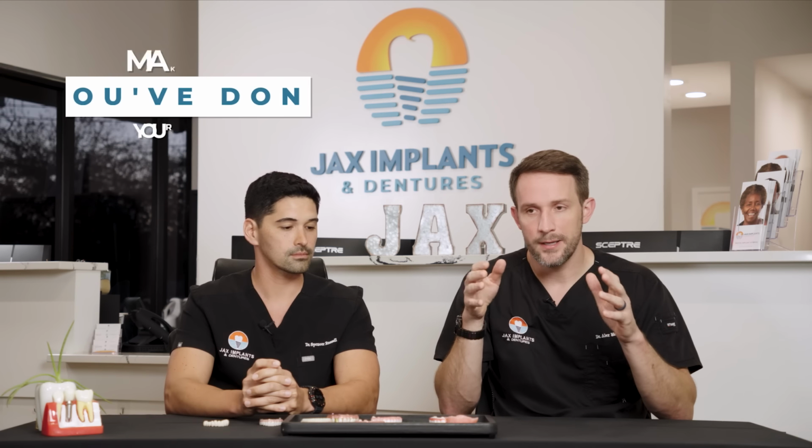It used to be something you could consider permanent, but we have much better materials now, something that's going to last much longer, for those reasons that Dr. McRee mentioned. You have to be a little cautious about the wording. They say fixed, permanent, but not final, and they get tricky with the wording. We've just seen it a lot. You do have to do some research. I'm not saying we're the final word on everything, but I do know a lot about this. And it's a little unfortunate because we've had patients come in who say, "Oh, I got my final," and I'm like, "That's not a final," and now it's broken. And then what? No, and then the last guy said it was a final.